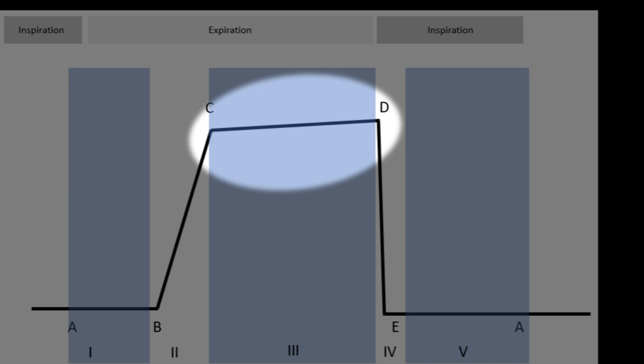Due to various pathologies, this slope can be increased, for example with bronchospasm, when the CO2 cannot be exhaled as quickly.